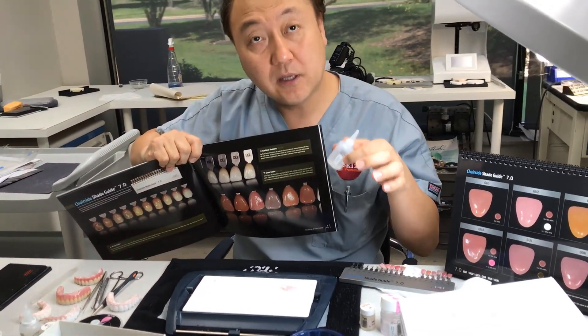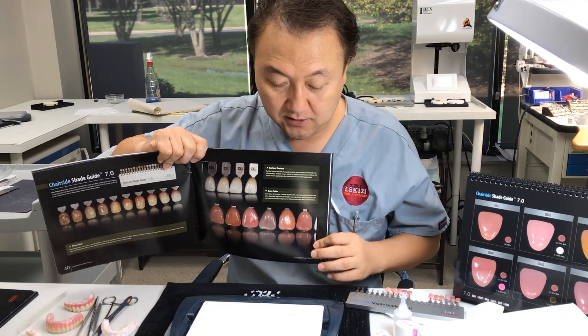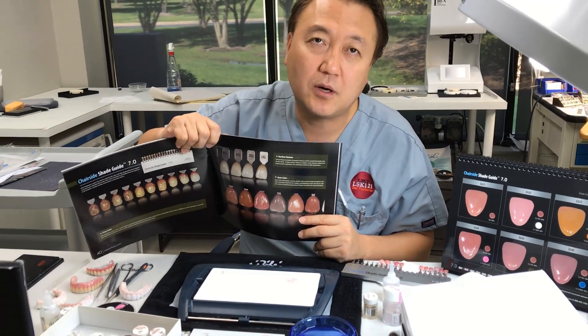But make sure this modeling liquid is completely thin, and then we add the stain. So you can do any kind of porcelain — not a problem.